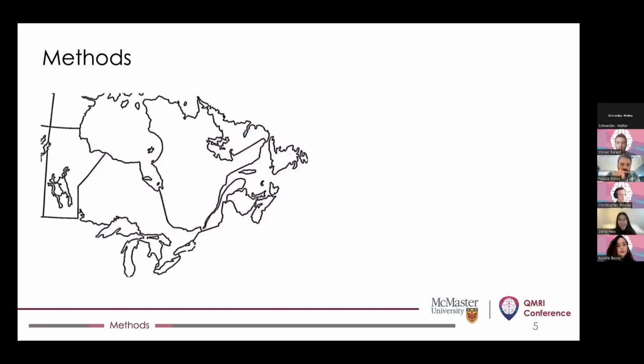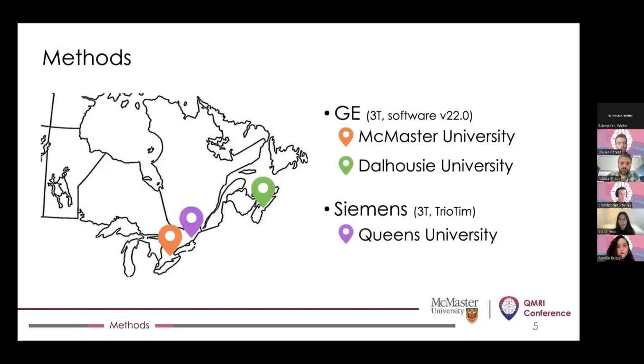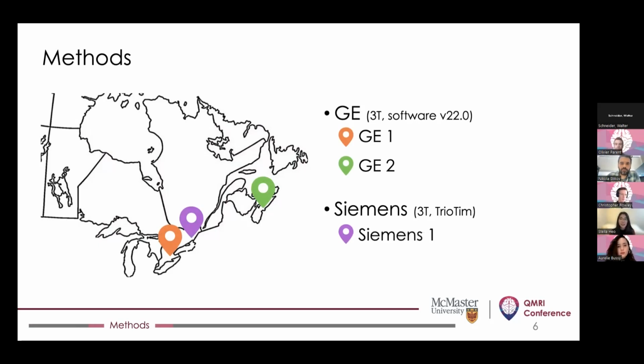So the data we are presenting here is part of a bigger longitudinal clinical study looking at bipolar disorder, but here we only included 3 sites that collected enough scans from healthy control participants. 2 of these sites used a 3T GE scanner, while 1 used a 3T Siemens Trio TIM scanner for image acquisition. And for this presentation, we'll just label these sites based on the vendors of the scanners used for simplicity.